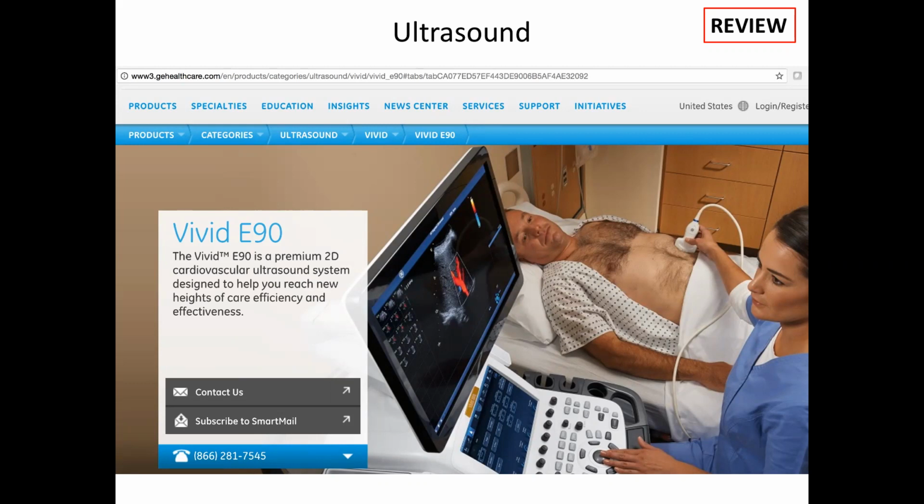And then they save that, and it goes into a folder that has many captured videos and measurements and things like that. That can vary from site to site, how they put that together.